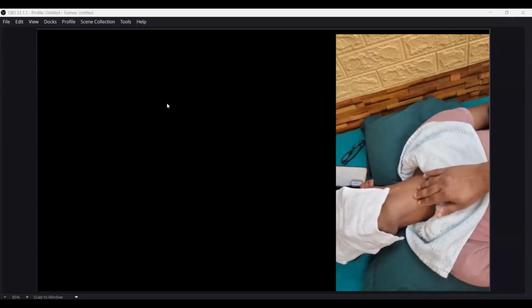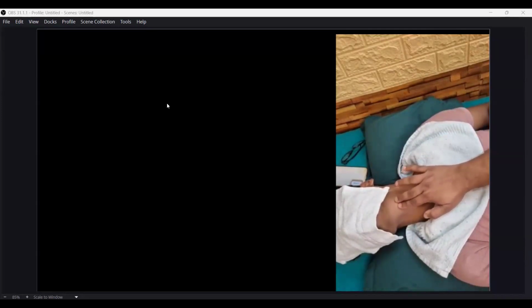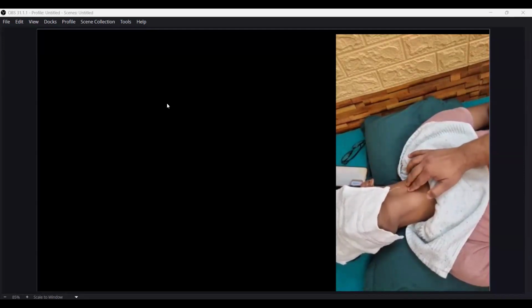So first the surface landmarks. Here we can see the thyroid cartilage, then the cricoid cartilage, then just by the side we have to find the Chassaignac tubercle. After we have located where it is, we go for the scanning. For all patients, I first go for the surface landmarks because it is very easy to find those structures.